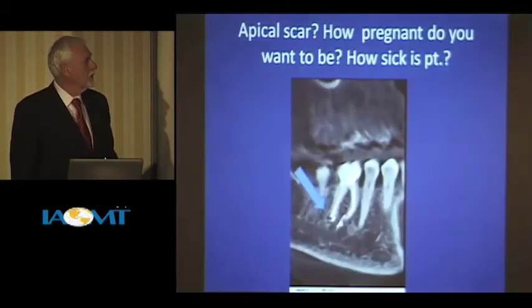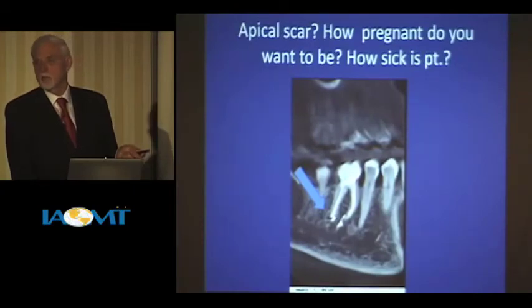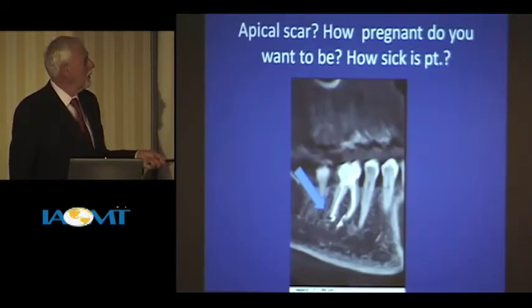And again, what I have seen and what I'm showing you is some of the small ones. I could have gone back and just picked up the great big ones, and you'd look at those and say, well, I can see those on my digital PA. Why would I want to spend $200,000 for this dumb thing?